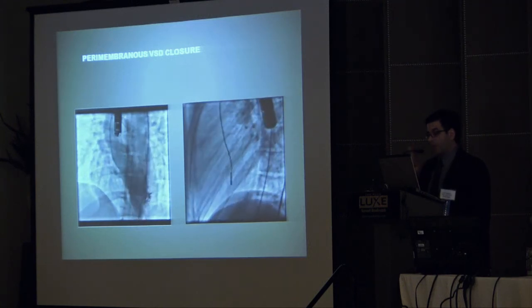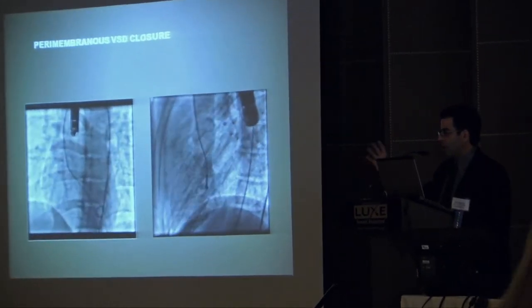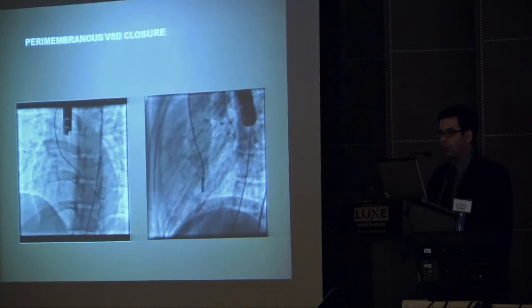However, I will tell you that more recently, with the application of rotational angiography, my practice has changed some, where I will do a lot more cases in a single plane lab if I can do a nice rotational angiogram and then come up with an optimal working view.